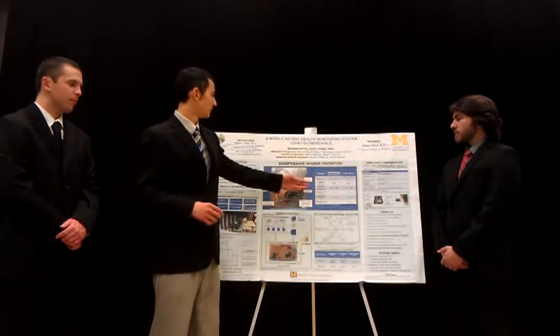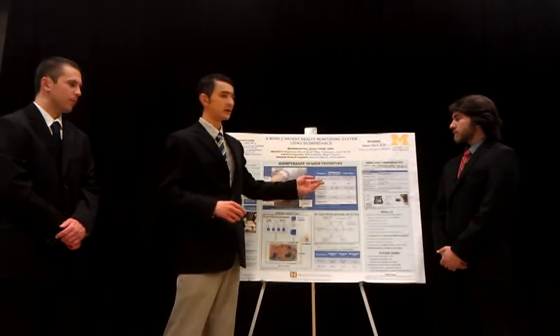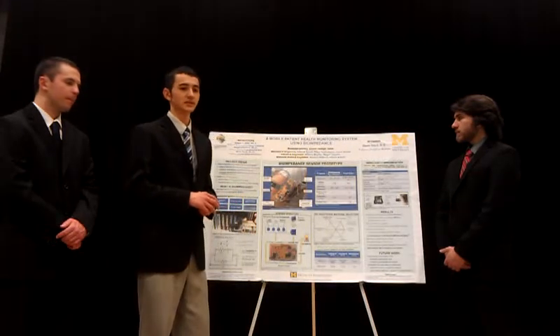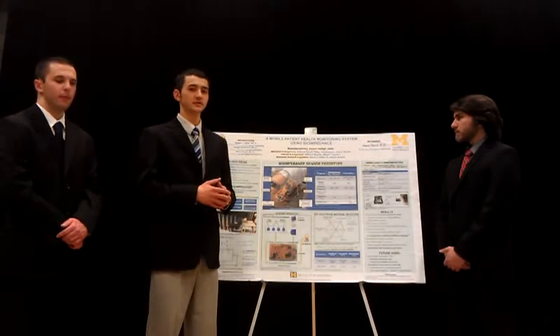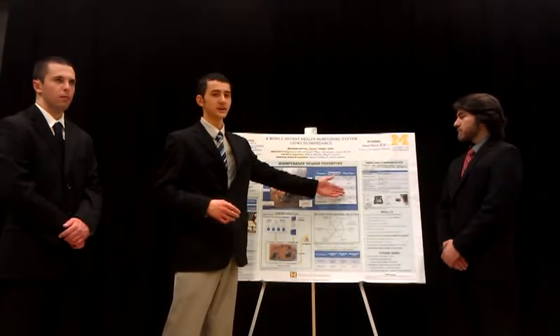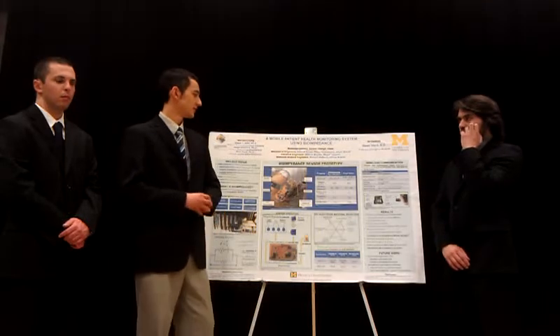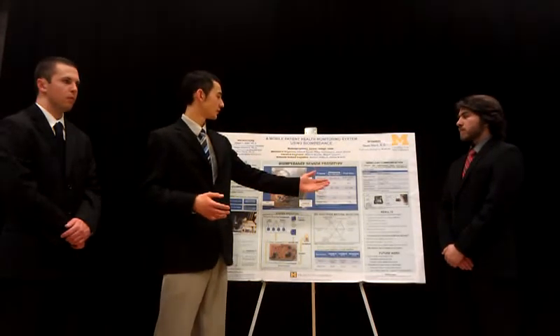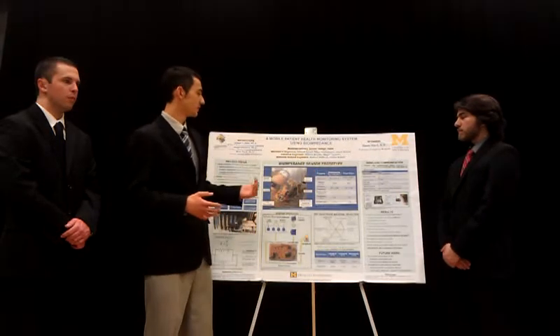We tested the wireless range, and it was from 10 to 100 meters, depending on the environment we tested. We also estimated battery life to be 12 hours. The frequency we're sending through the person is 40 kilohertz in order to identify the bioimpedance.